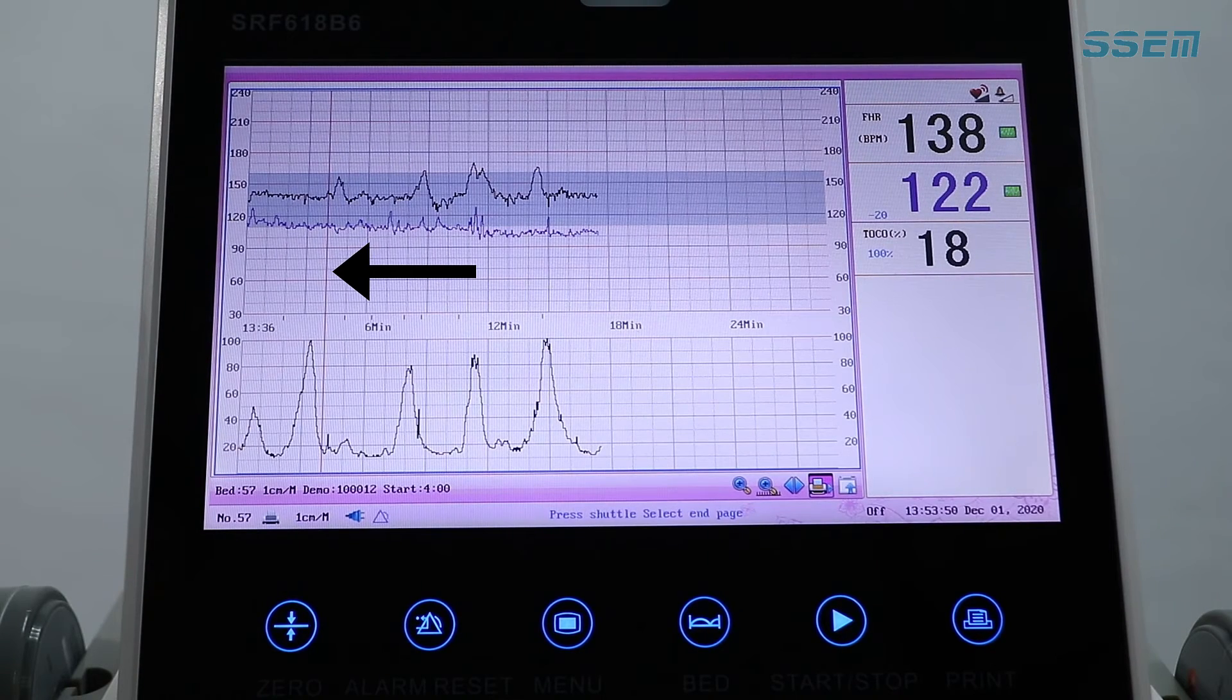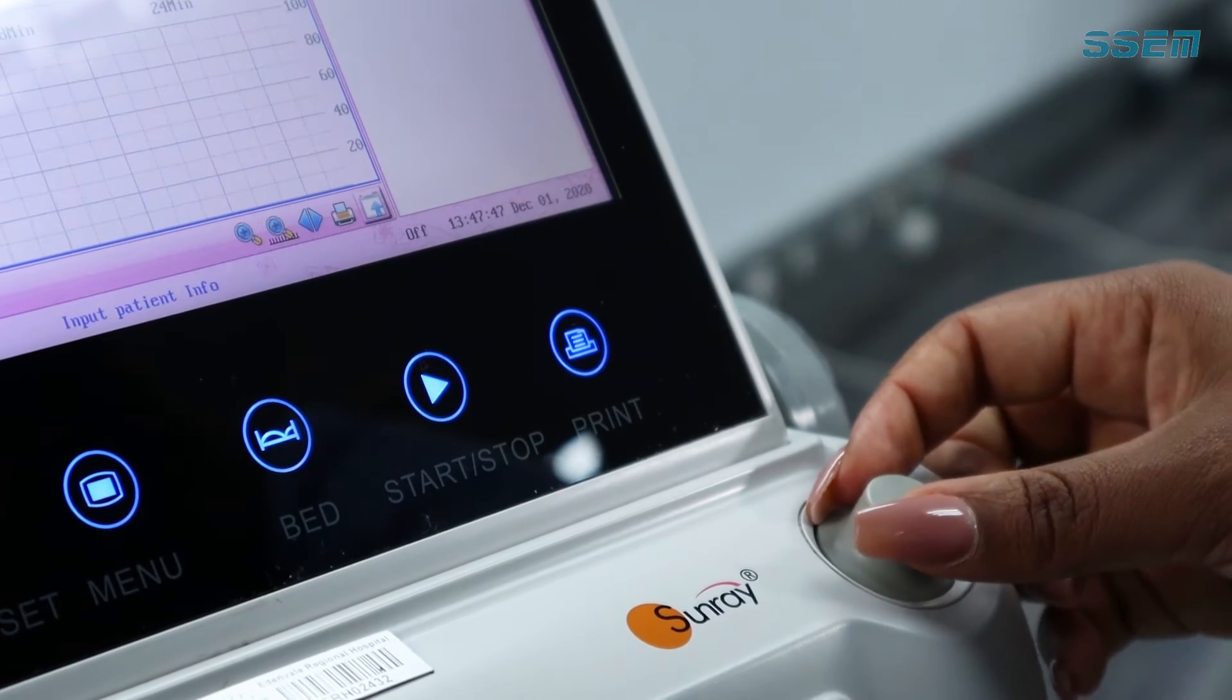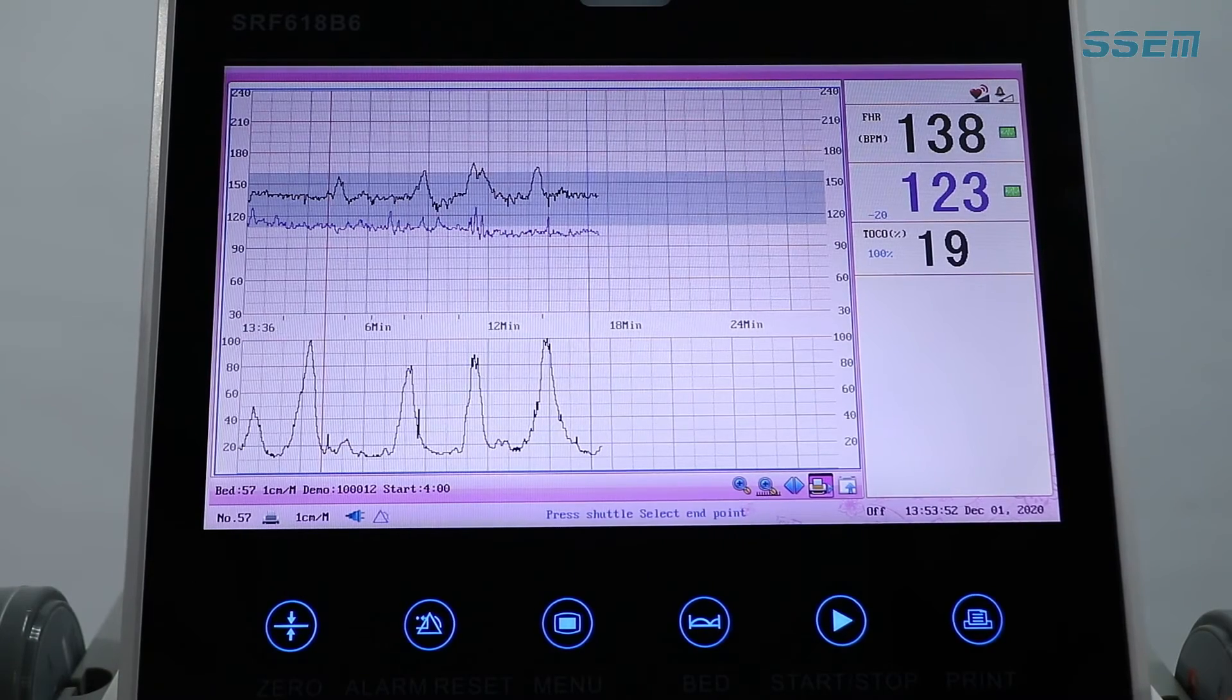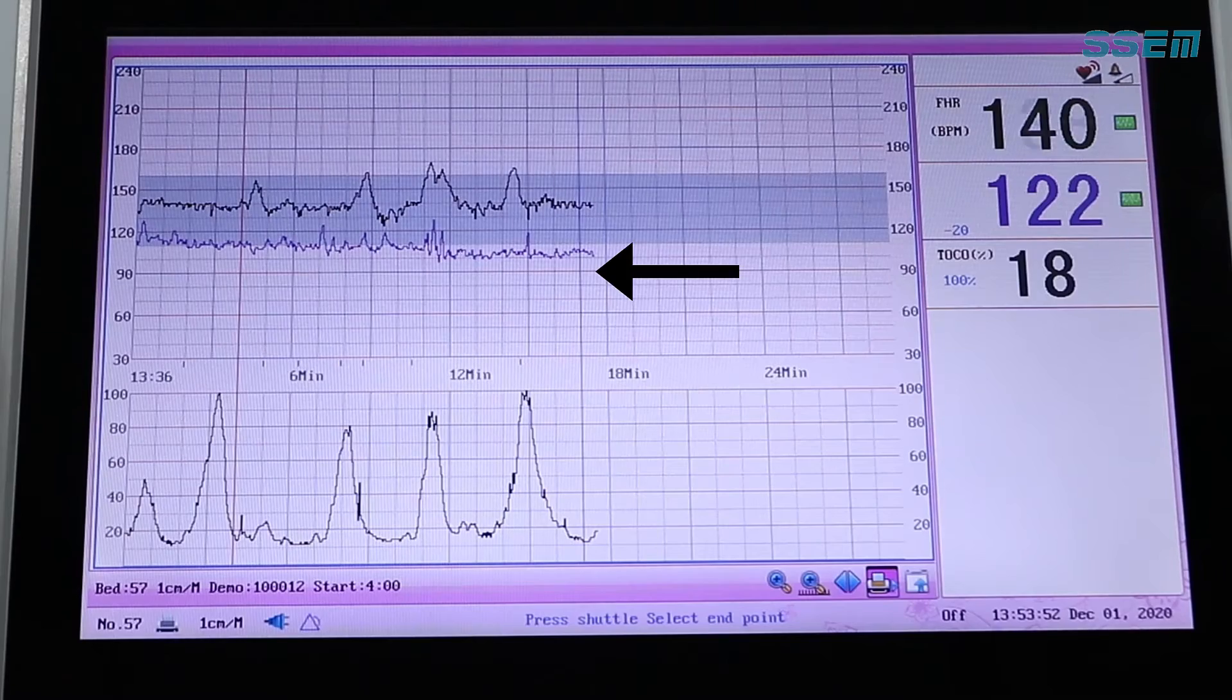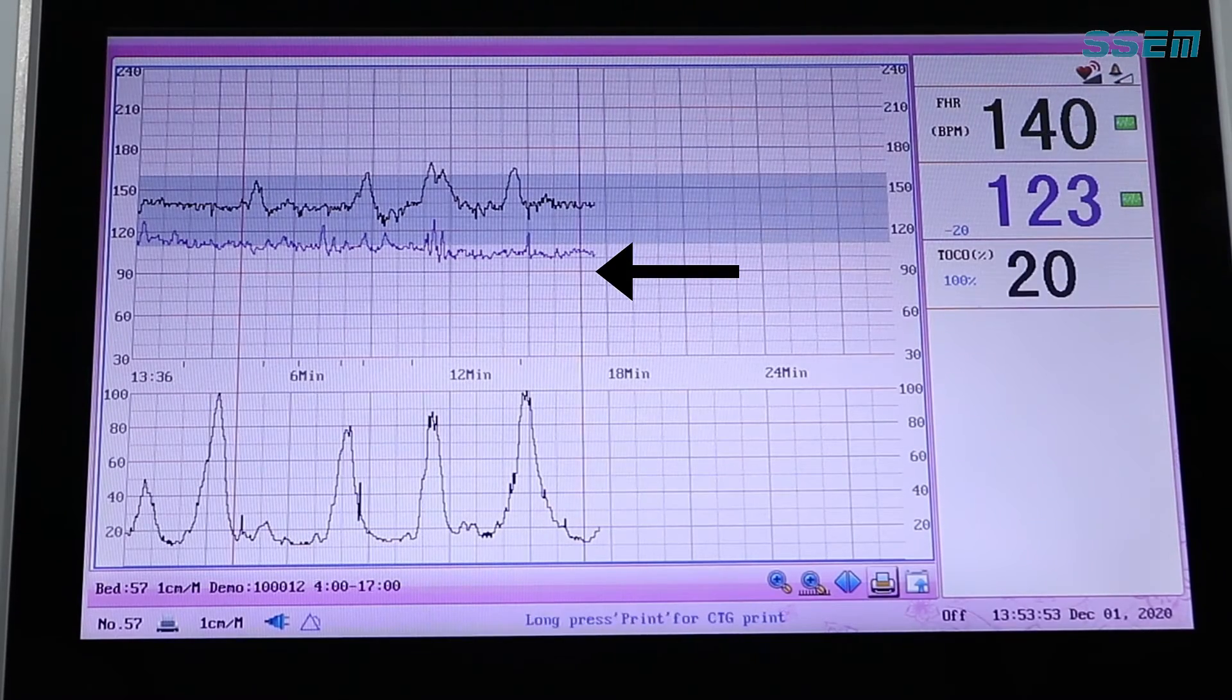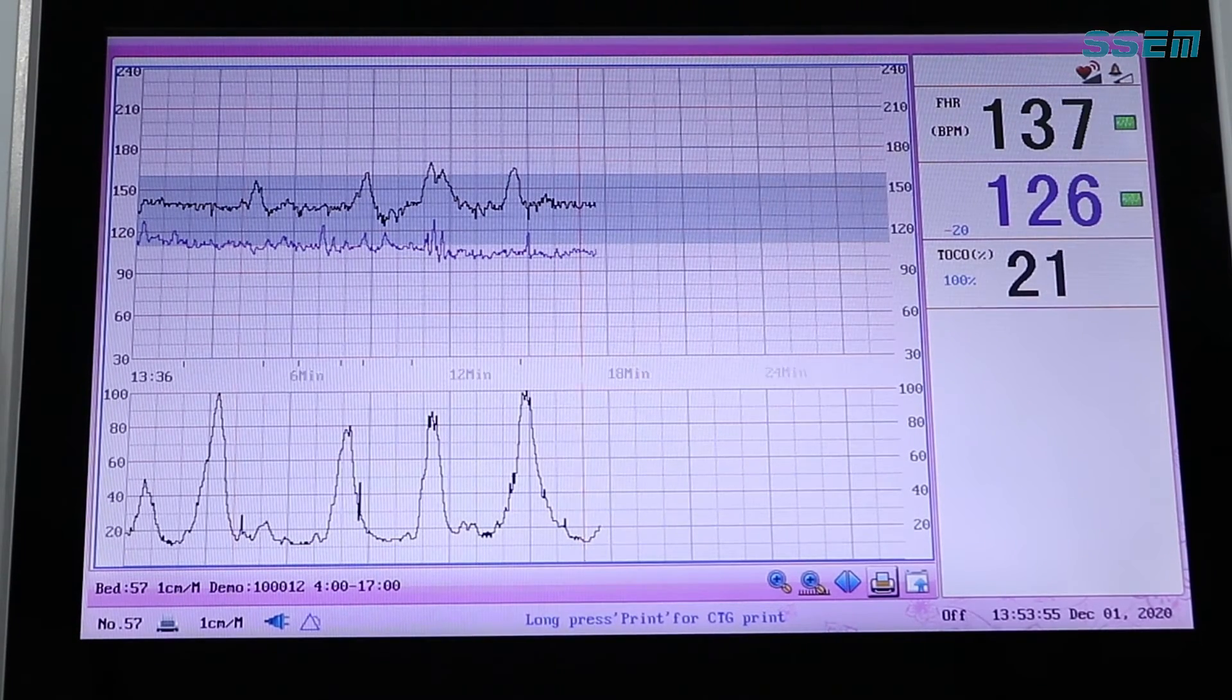Place the blue line where you would like the printout to start. Confirm with the control knob and the line will turn red. Click the control knob for a second time for the second line to appear. Place the line where you would like the printout to end and confirm.